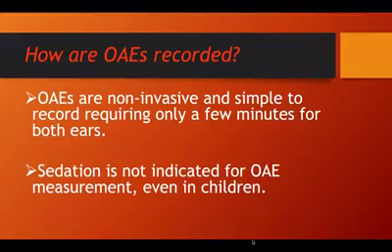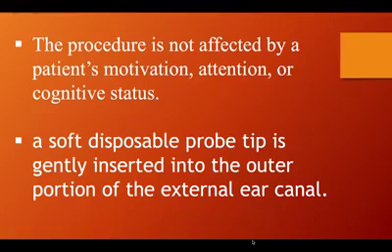Otoacoustic emissions are non-invasive and simple to record, requiring a few minutes for both ears. Sedation is not indicated for otoacoustic emission measurement, even in children. The procedure is not affected by the patient's motivation, attention, or cognitive status. A soft disposable probe tip is gently inserted into the outer portion of the external ear canal.